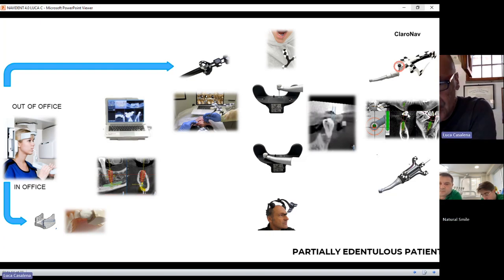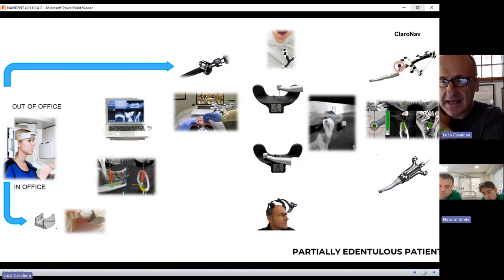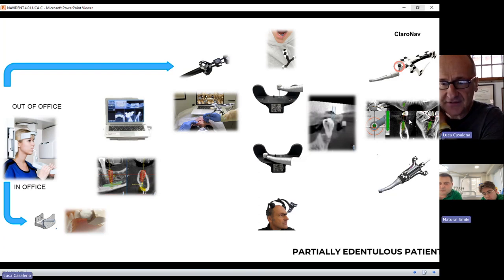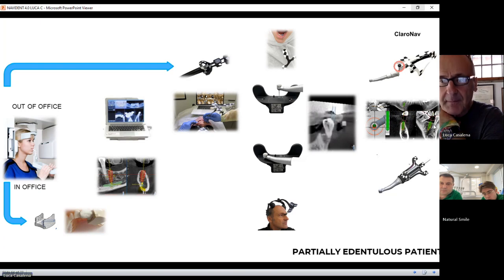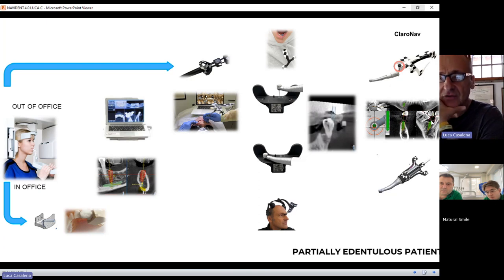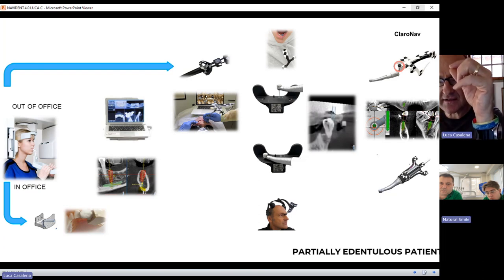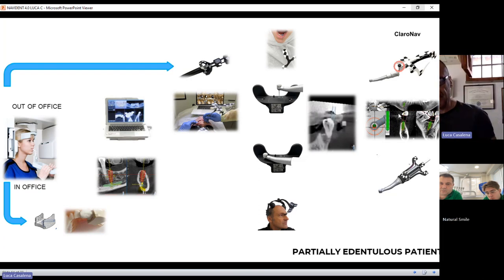There is a second mode of operating without any plan, where you go straight by drilling in the area where you want to drill. In this case, you see exactly what you do on the patient's anatomy. In either mode, you will be guided to see in real time what you do on the patient's anatomy.